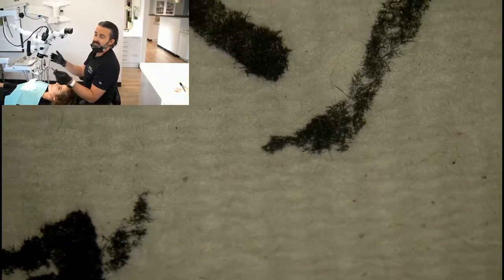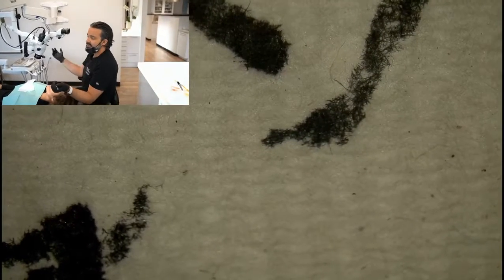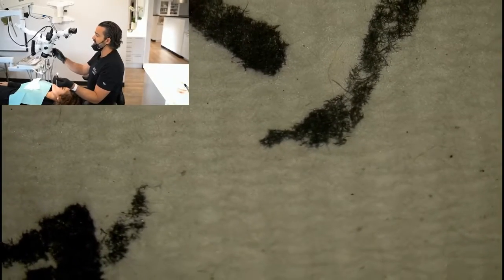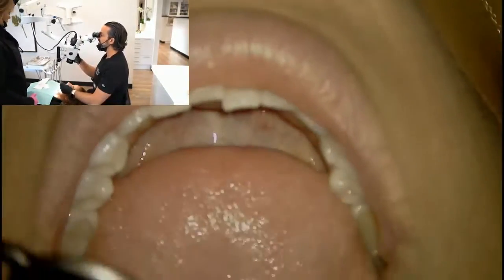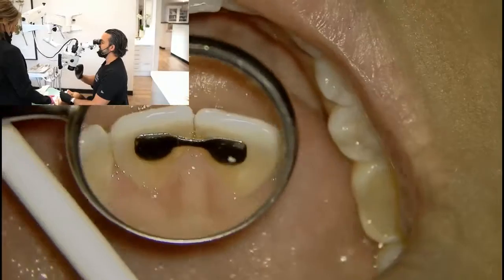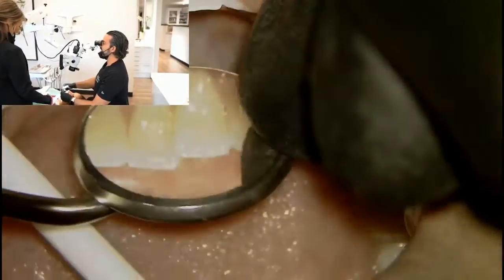The reality is people move, and you might bend over, and the chair might move, the patient moves or swallows. So I find that not a useful trick, because it's really quick just to work where you want to work, and then just fine focus things down as I work. And so with my arms, I go back to her mouth. If I want to jump up in magnification, it's so quick just to do this and then I'm in focus. I will move my wrist like this often enough. And it's just real life.